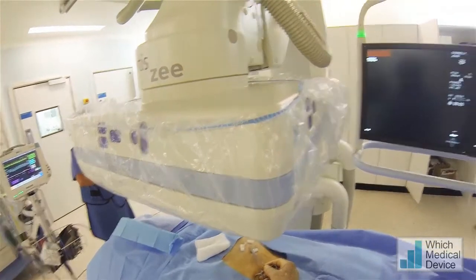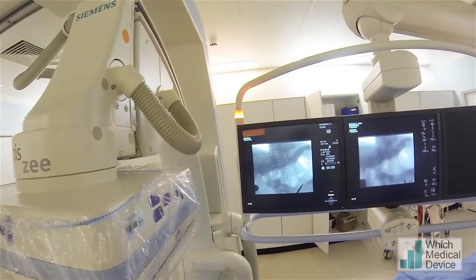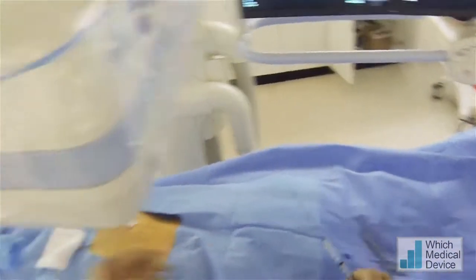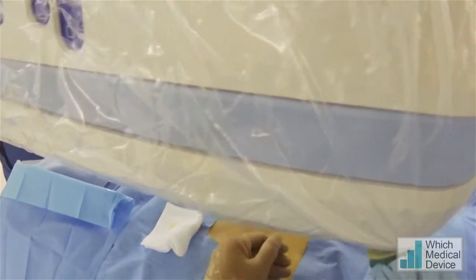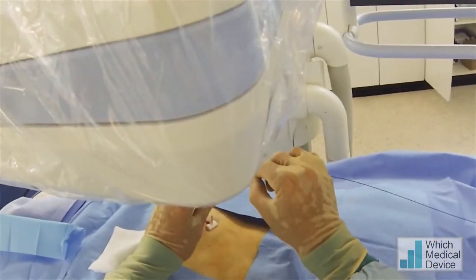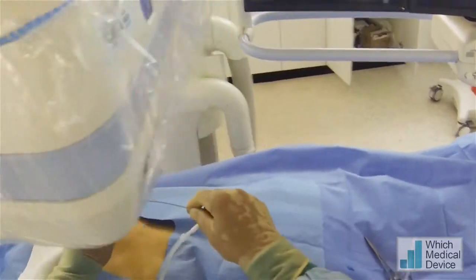We'll just check the position for the gastrostomy in the middle. Angled superiorly, that position will be absolutely fine. Just making a small incision for the gastrostomy. Now we're going to use the Gastropexy needle to puncture the stomach again. We've got air back, happy with that. Then going to use a super stiff Amplatz guide wire, which I'm feeding into the stomach.